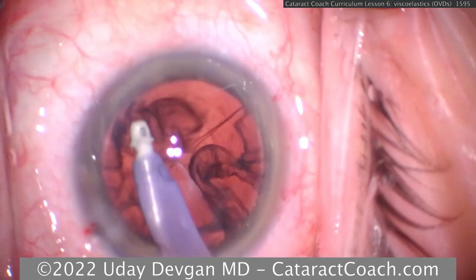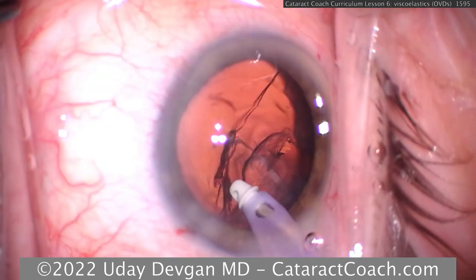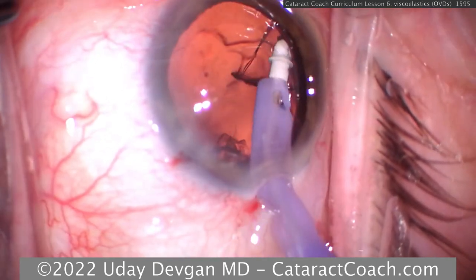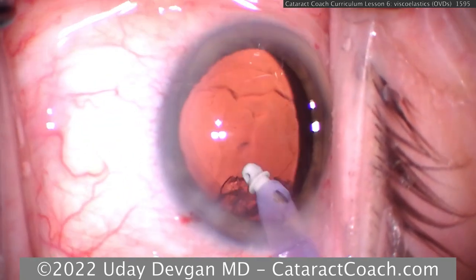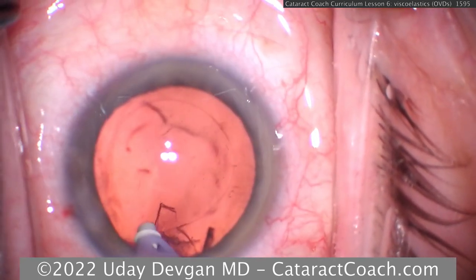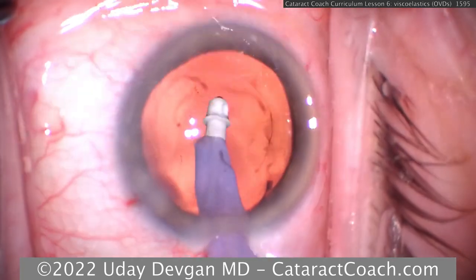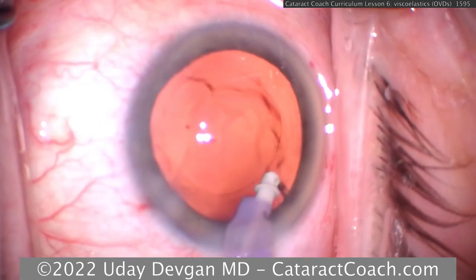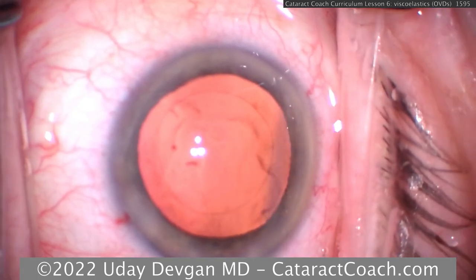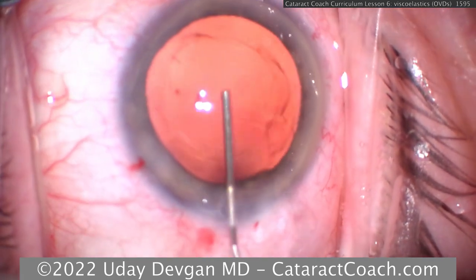Remember, there's a whole spectrum of viscoelastics beyond just the two big categories of simply cohesive and simply dispersive. Combination OVDs tend to be in the middle of the spectrum, and they may have some dispersive properties as well as some cohesive properties. For many surgeons, using a moderate OVD has the best of both, and they're able to use that one single viscoelastic for the entire surgery. Examples of this include DiscoVisc from Alcon or AmVisc Plus from Bausch & Lomb.